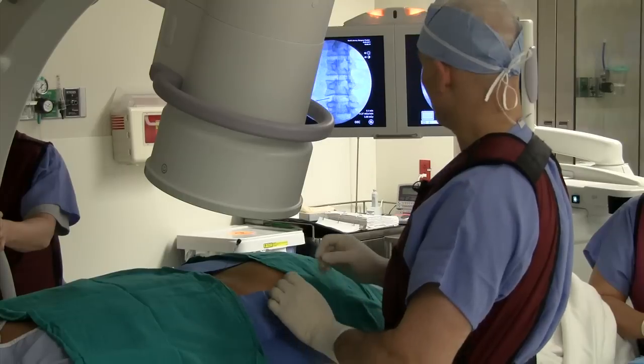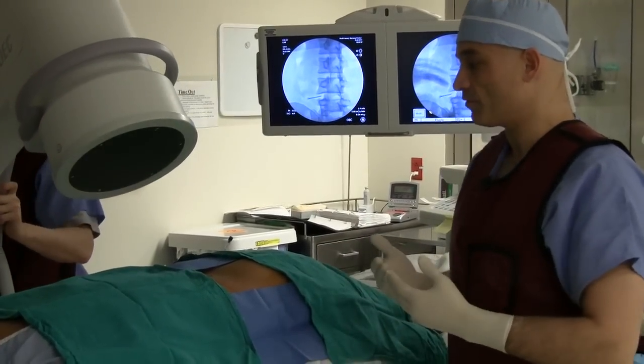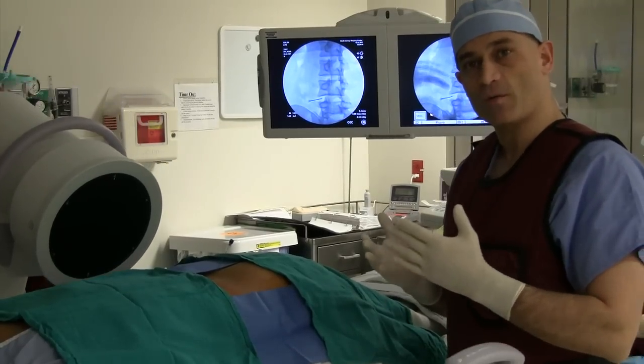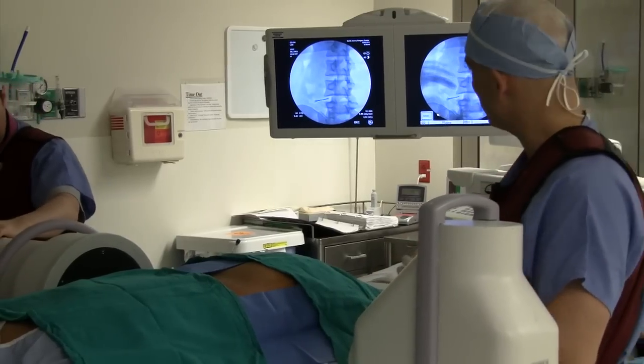Okay, lateral, please. We're now going to turn the C-arm into a lateral view, and this is another fluoroscopic angle that allows me to advance the needle tip safely.